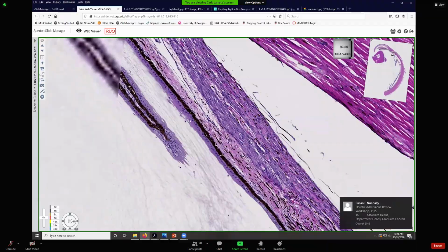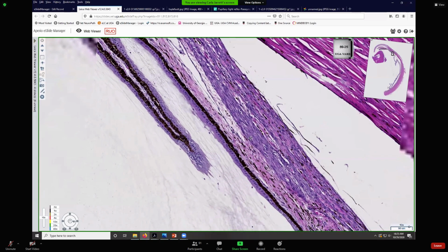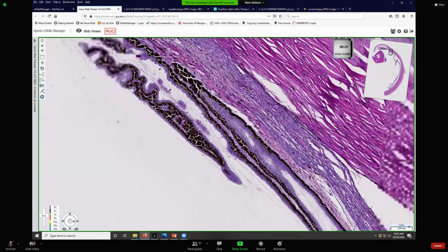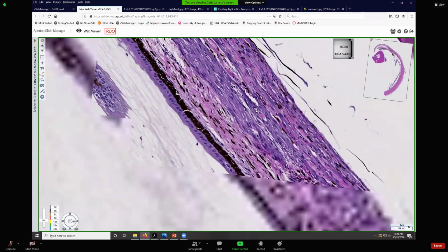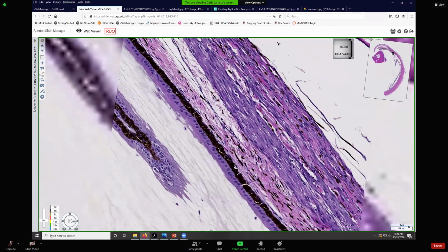It's overlaid with the non-visual portion of the retina. So even though that belongs to the neuroepithelial tunic, because it's so intimately associated with the ciliary body and with the iris, we're going to talk about it at the same time. So here in this ciliary body, we have mostly just collagen and blood vessels, which is kind of what the uvea is all about. But then we start getting smooth muscle.